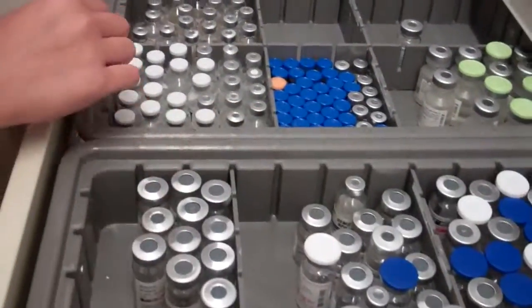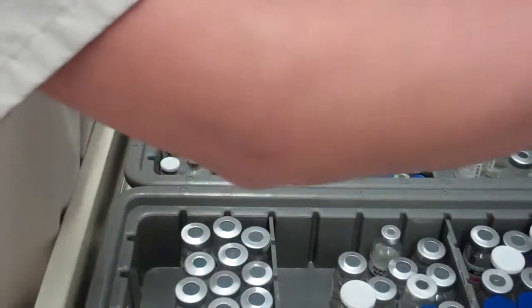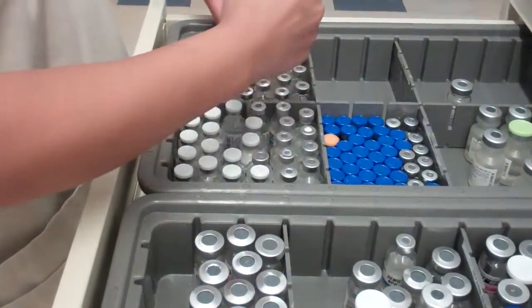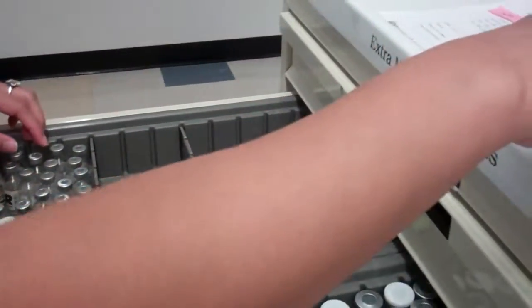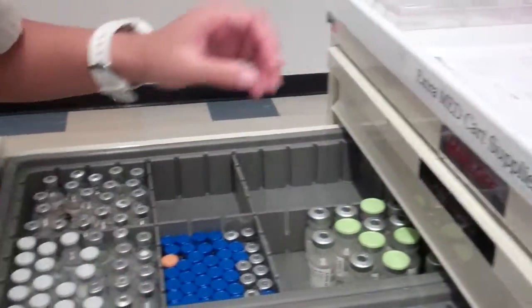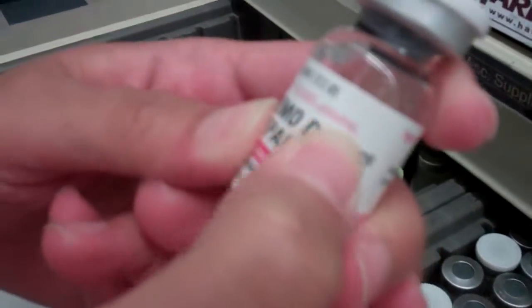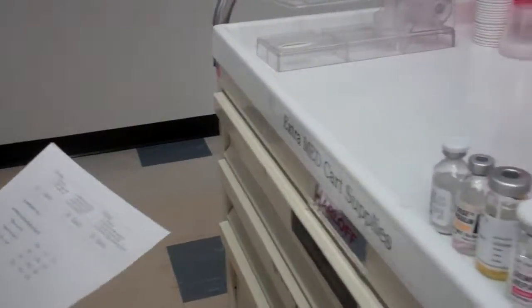I have my NPH, I have my regular, my Ansef, and my heparin. I have 5,000 units, so I'm going to get the 10,000 heparin. And make sure it's 10,000 units per 1 ml. That way I can give half.